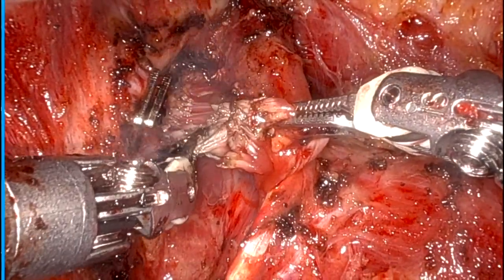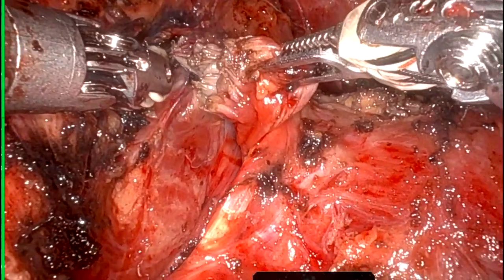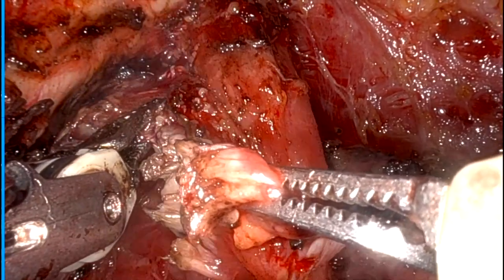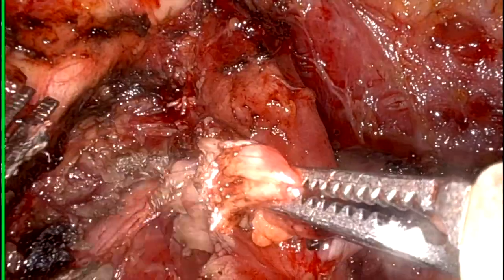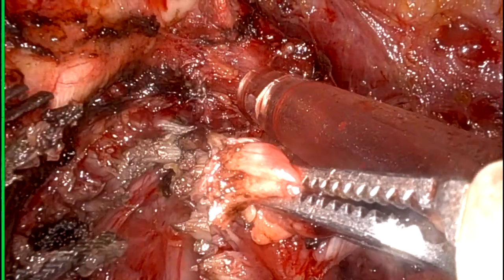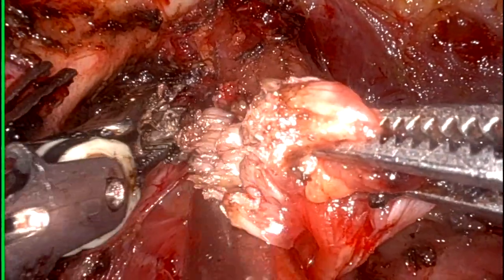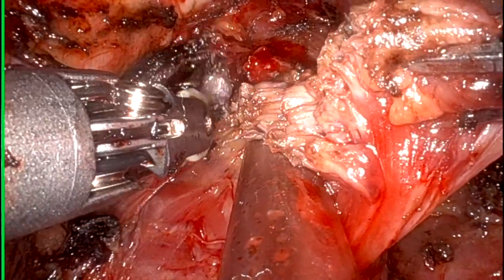After this neck dissection, we did primary resection. In primary resection, we did segmental mandibulectomy. The anterior cut for the segmental mandibulectomy was placed intraorally, while the posterior cut we placed from this incision only. Anterior fibula fixation was done intraorally, while posterior was done through this incision only. Microvascular anastomosis was done with the superior thyroid artery and internal jugular vein with this incision only.